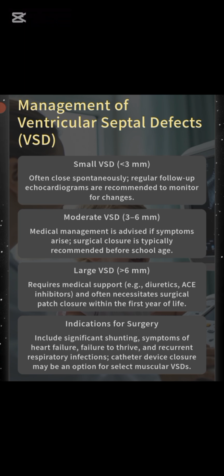So I hope you will understand the VSDs, the types of VSDs, and the size of the VSDs, how we take the size of the VSDs, and the hemodynamics also.